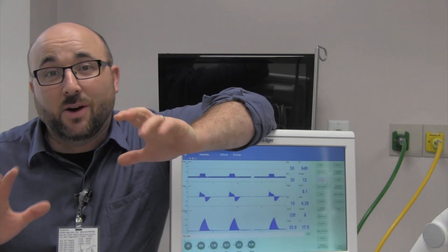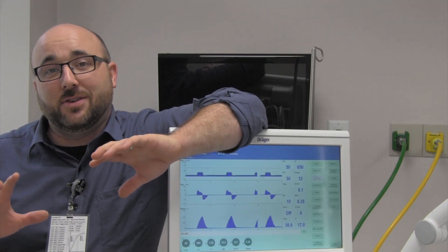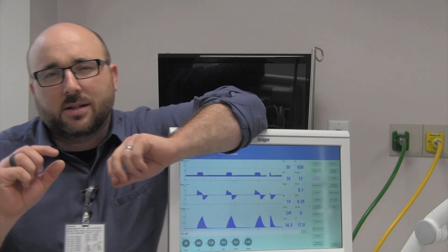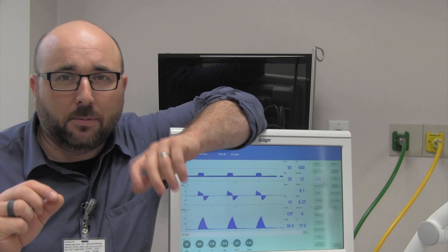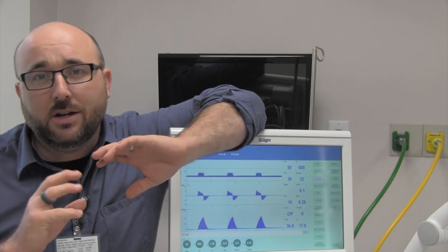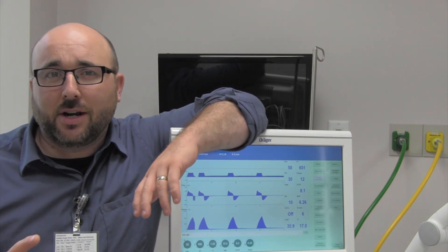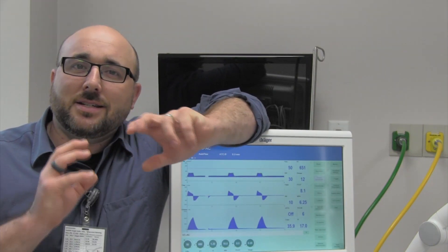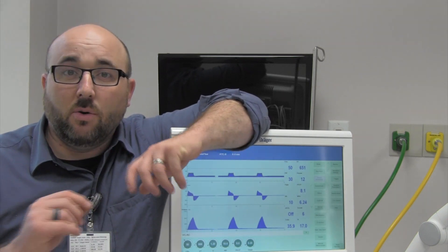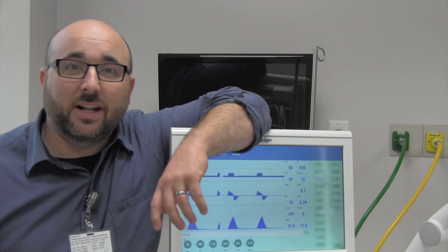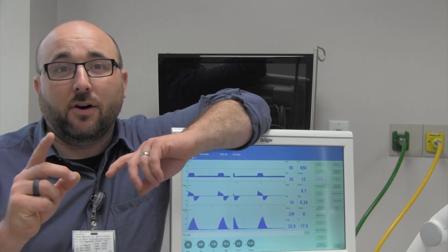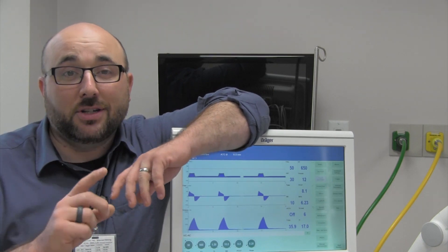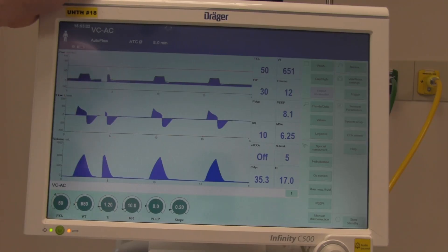I'm sitting here with the Draeger V500 and I'm going to show you some particulars about plateau pressure — why do we care about it, why are we measuring it, and how it relates to static compliance. Let's get to the ventilator so I can show you how to check a patient's plateau pressure.